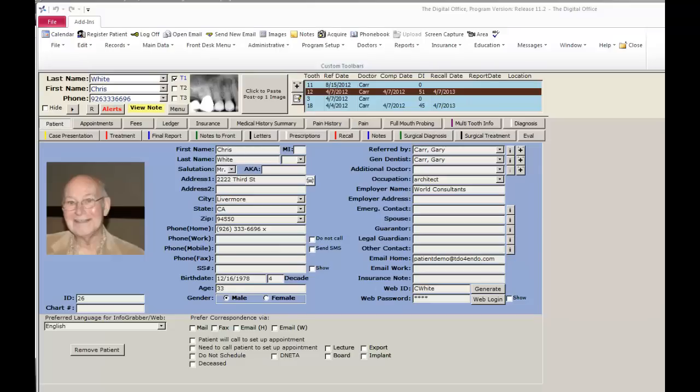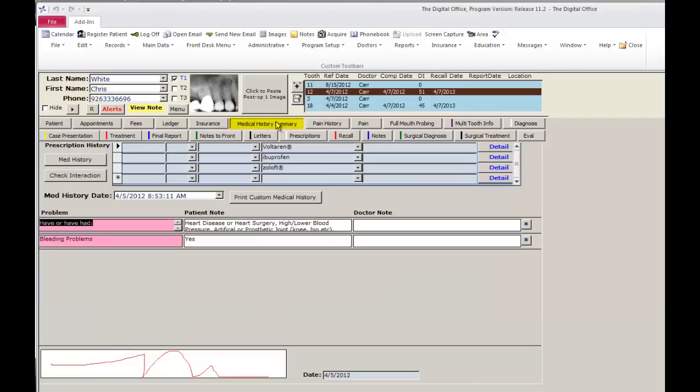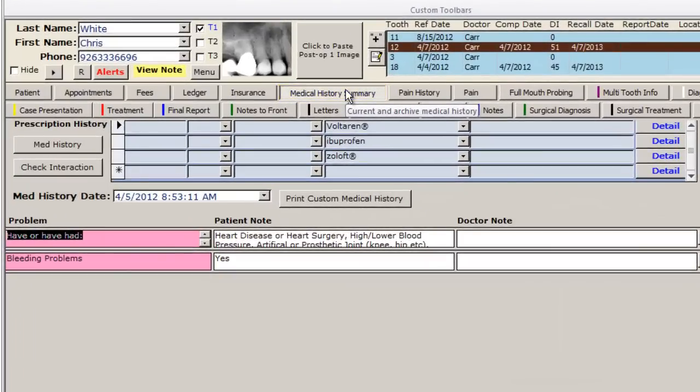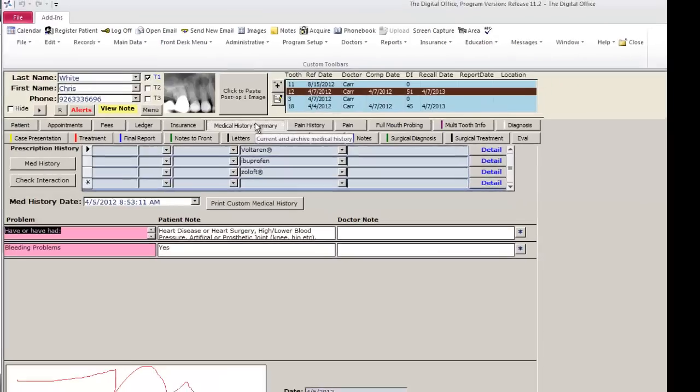Once in the operatory with the patient, the first step in the TDL flow is to go to the medical history summary. It is important to review the entries entered by the patient to confirm that everything is correct.